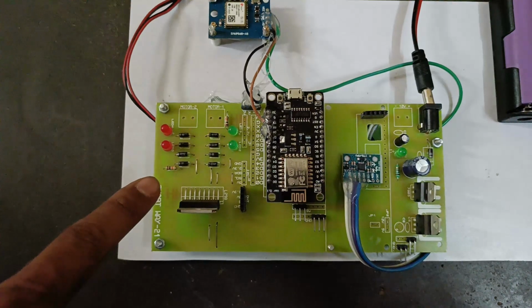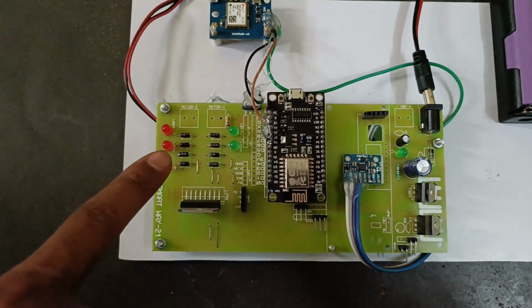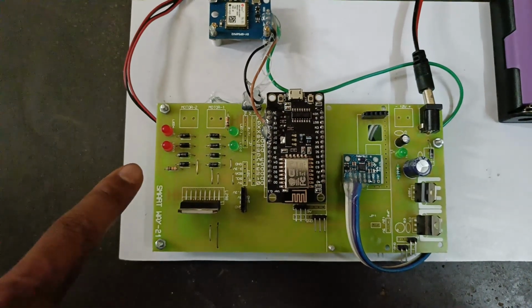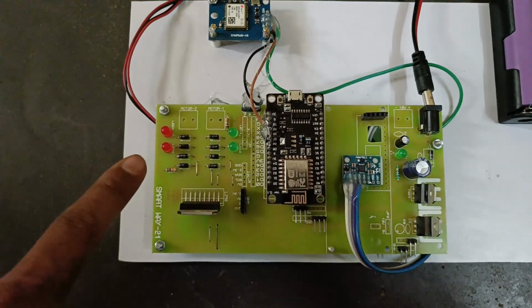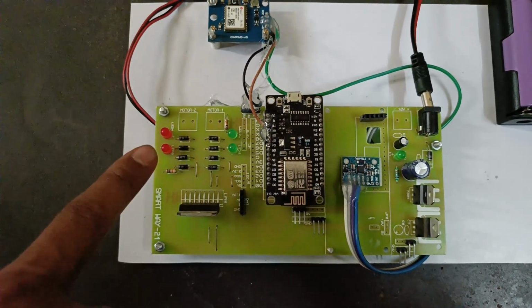The data value 1 will be considered as stop. Whenever the wheelchair is moving forward and the user's head tilts backward, the 1 will be generated, and that 1 data will stop the wheelchair within a second.